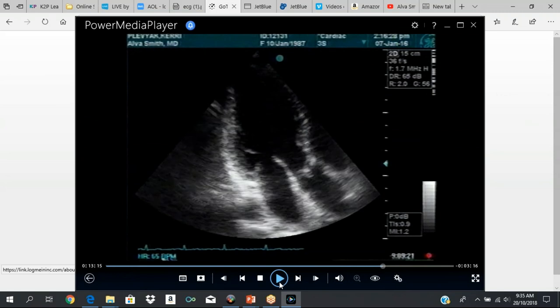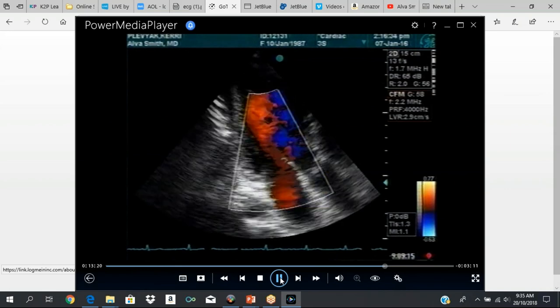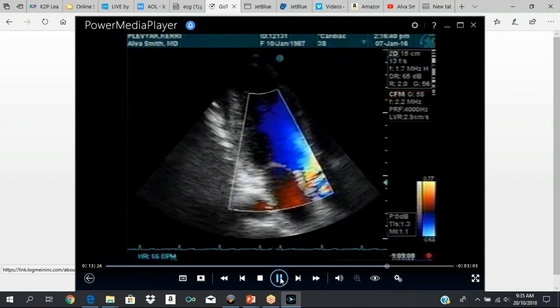To get to the three-chamber view, you do further counterclockwise rotation. After you get your two-chamber view, a little more counterclockwise rotation gives you your three-chamber view — three chambers because you get your LV cavity, the left atrium, and your aortic valve, aortic root, and ascending aorta. This is your inferior lateral wall, and this is your anterior septal wall. Further counterclockwise rotation from the two-chamber view.